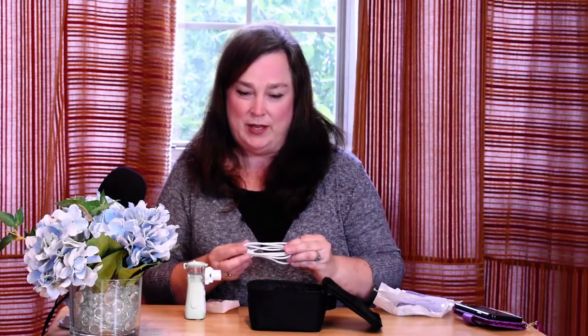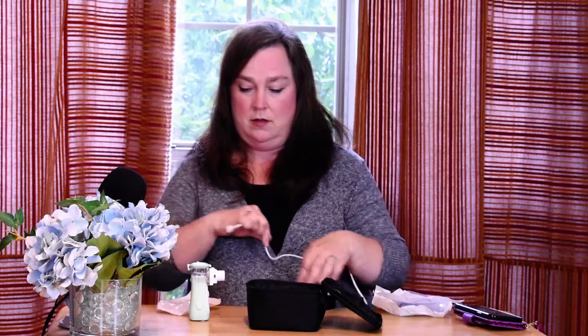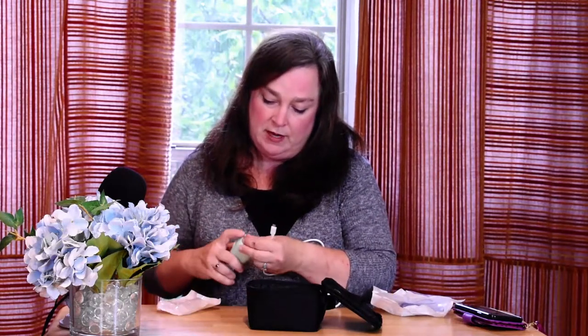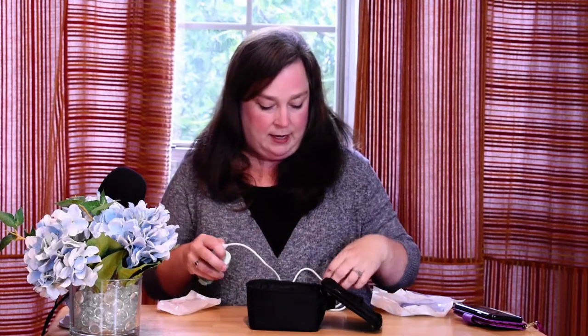This nebulizer also comes with a charging cable. This cable plugs into the bottom of the nebulizer, and the other end can either plug into a charging block and into your wall outlet, or it can be inserted into the USB plug on your computer.